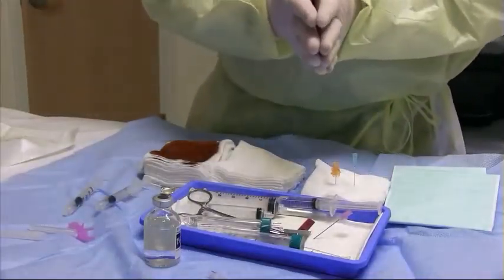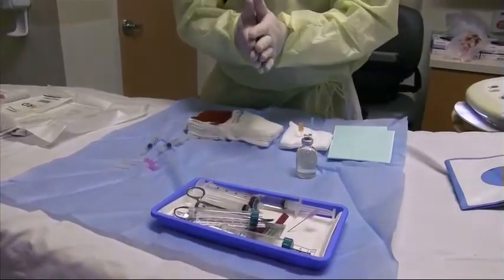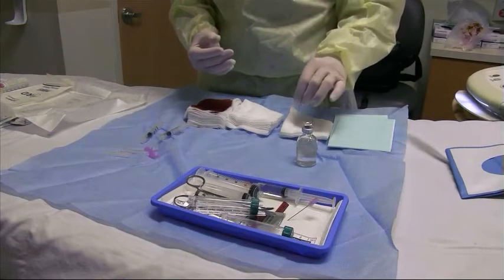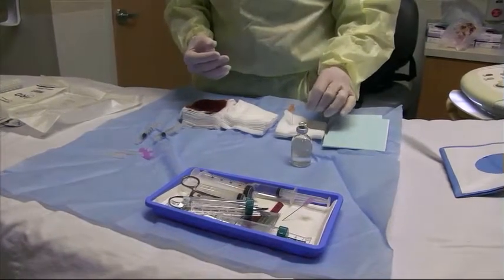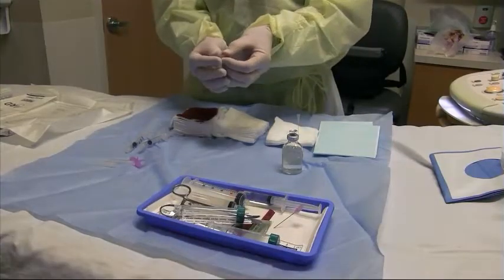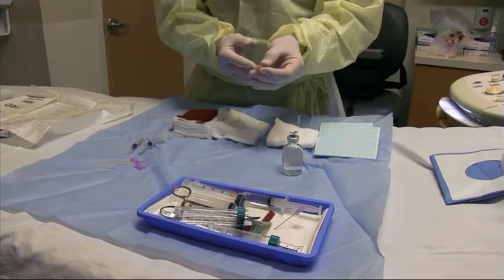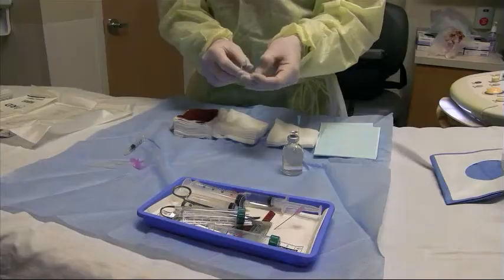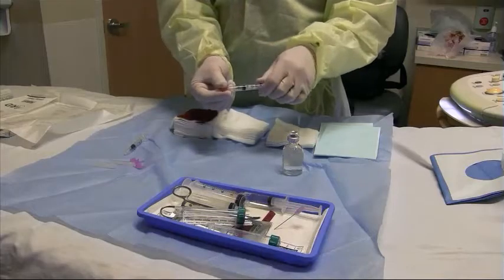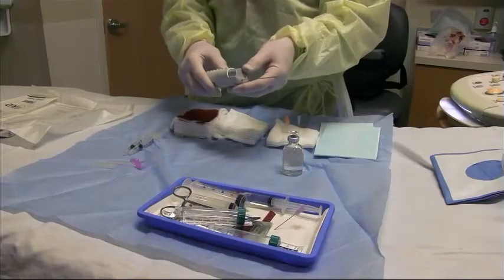Different attendings will have different setups — this is the one I prefer. For the biopsy we generally use very thin 25 gauge needles; sometimes for a larger sample we may use a 22 gauge needle. These are inserted into the patient without a syringe — cells are drawn up into the needle through capillary action by a back-and-forth motion once we're in the nodule. You could place a syringe onto the needle to apply suction, but I find this just draws up more bleeding and is usually not necessary.